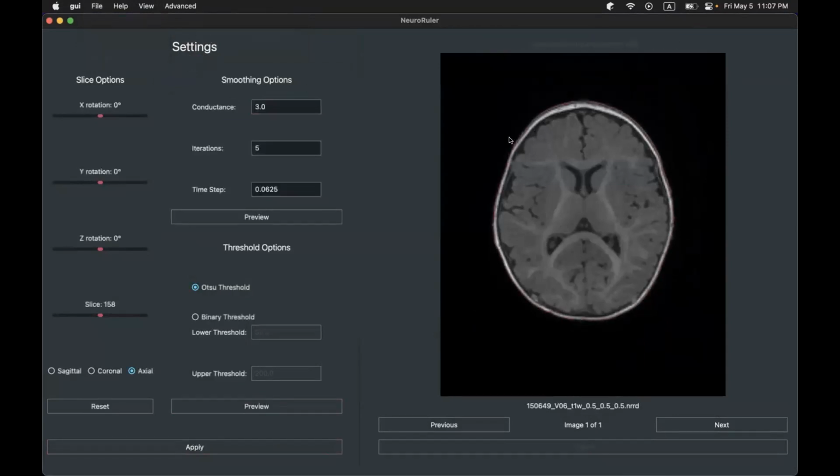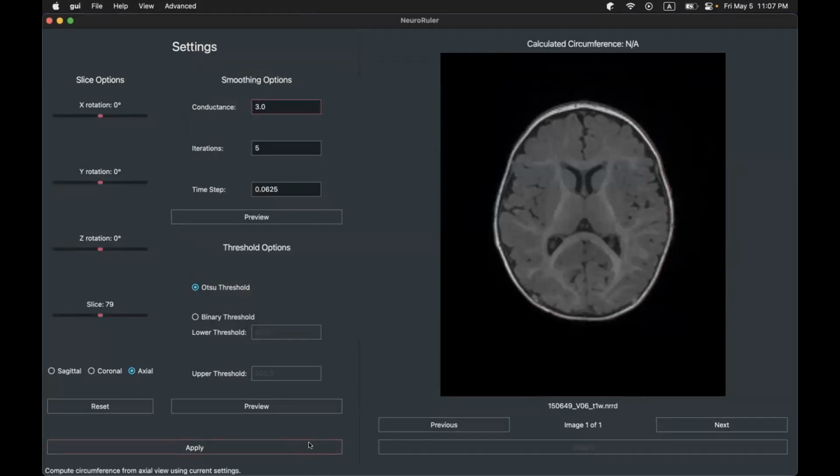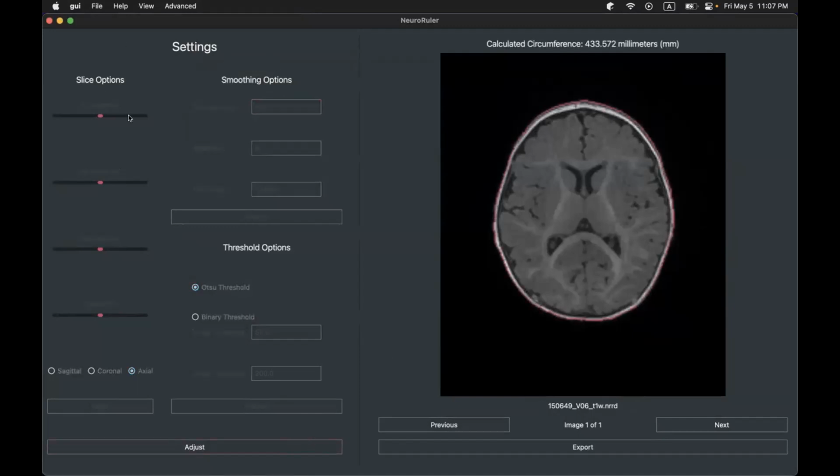This image was actually constructed, so this one was made from that, and we just changed the spacing values manually. So if you remember from before, the 0.5 spacing one was about 442. So this was the base image that was generated from. You can see that the circumference is pretty much the same, even though the spacing was totally different. So we do handle relatively correct calculations for non-1, 1, 1 pixel spacing. It doesn't have to be exactly correct. There is like a small bit of inaccuracy, but that's expected.